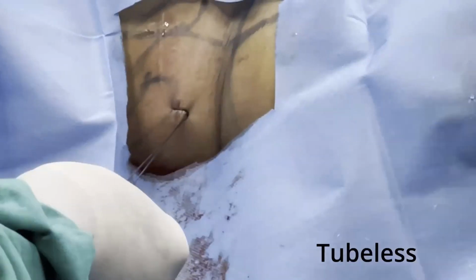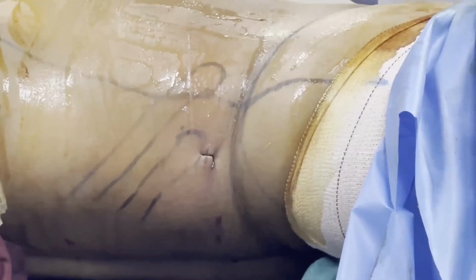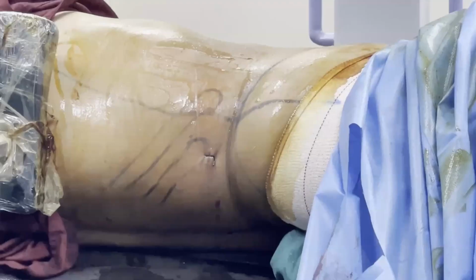After that, because the tract size is very small, we don't routinely put tubes in our patients, and all these cases are done under spinal anesthesia. So we can even discharge this patient within 24 hours. That is the ambulatory tubeless supine mini PCNL that we do routinely in our practice.